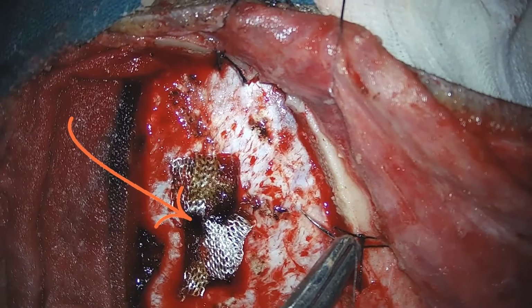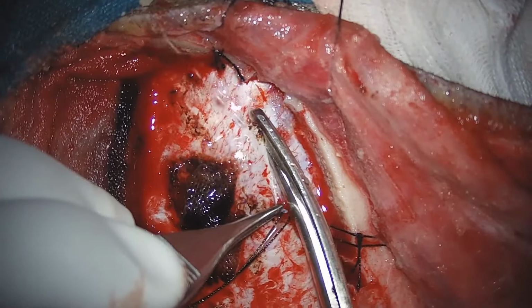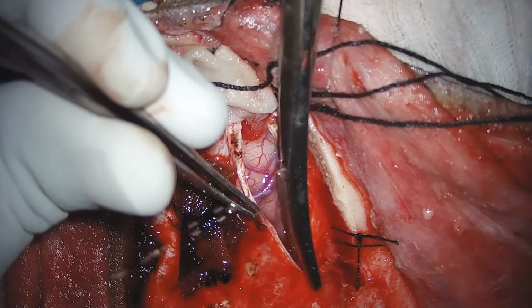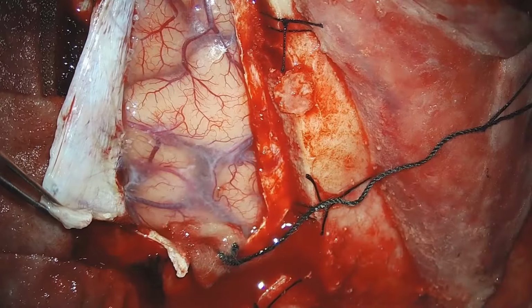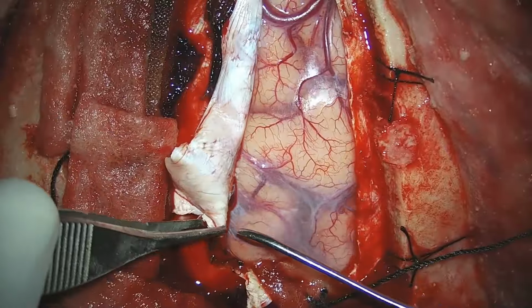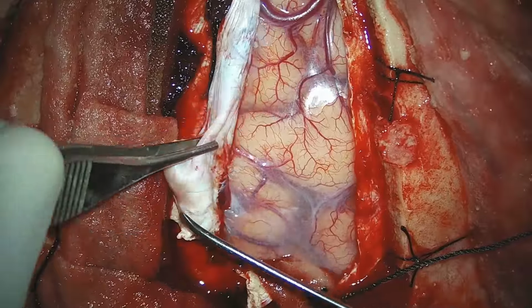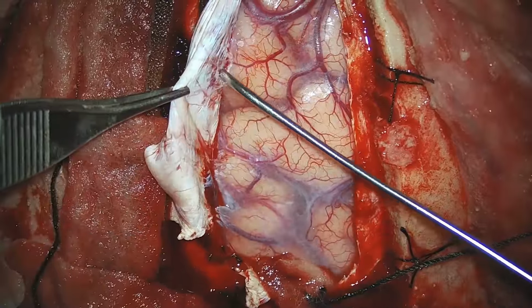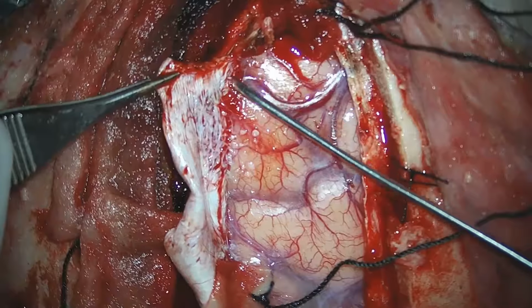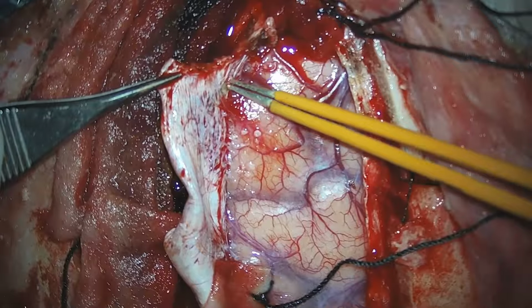Here we can see the superior sagittal sinus and we are slowly opening the dura, exposing the frontal lobe up to the interhemispheric area. Now we are carefully dissecting out the bridging veins that are going into the superior sagittal sinus without damaging any tributaries. We can also see the arachnoid granulations on the under surface of the dura. Now we are carefully separating the bridging veins with sharp dissection.